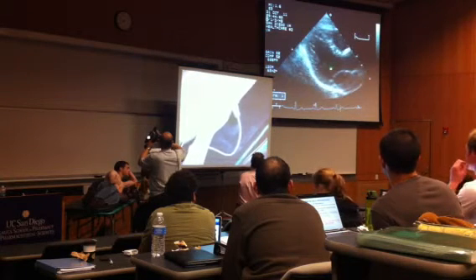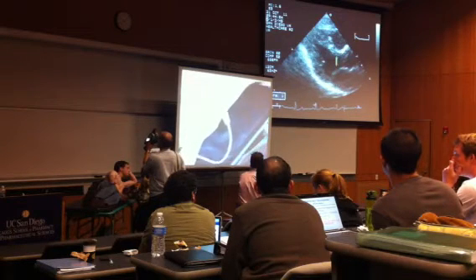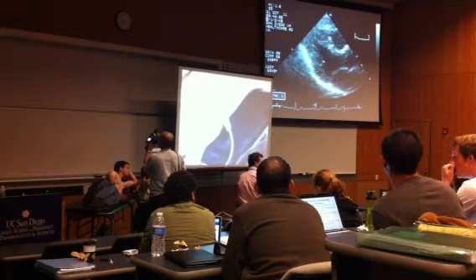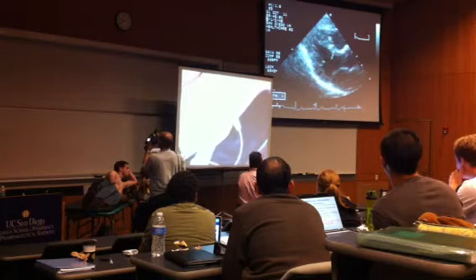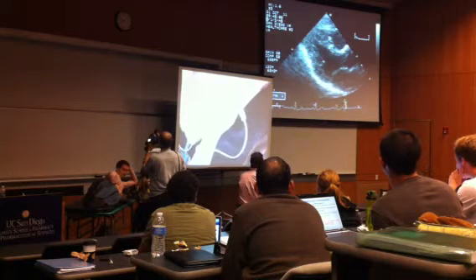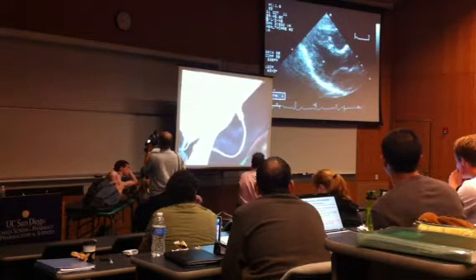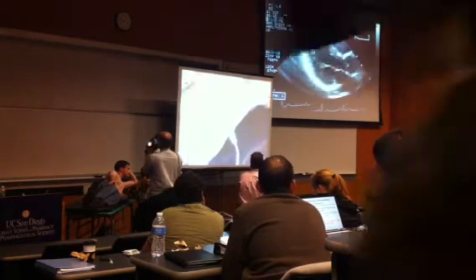Let's watch our ventricular chamber. And you see it contracting. We can estimate that by its smallest dimension. It's not perfect, but it's pretty good. This is end systole. Okay? And we can get more precise than that. So let's go back to real time. Let's put on some color flow here.